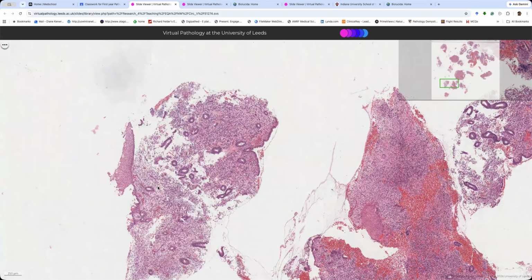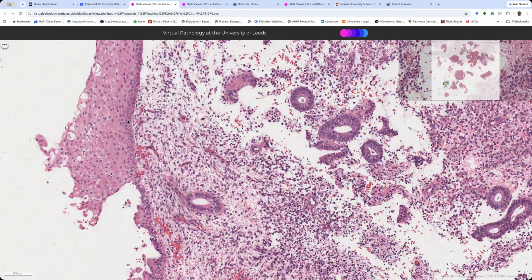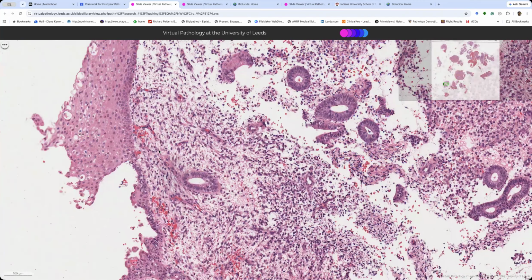So I did promise you some squamous metaplasia. So you've heard of morular metaplasia. It used to be called squamous metaplasia, but it was confused with squamous metaplasia on the surface here. So I suspect this person might have had an IUD in, the old-fashioned non-hormonal thing, for a long time, because this is true squamous metaplasia of the endometrium.